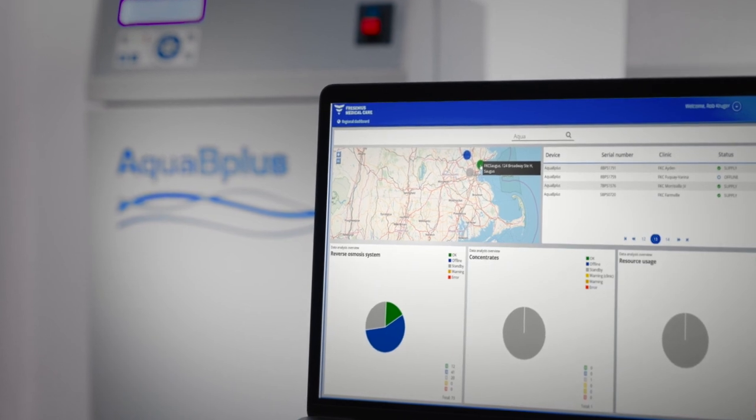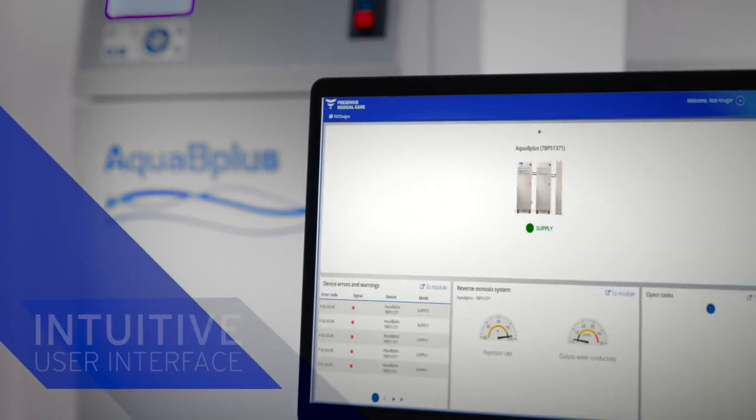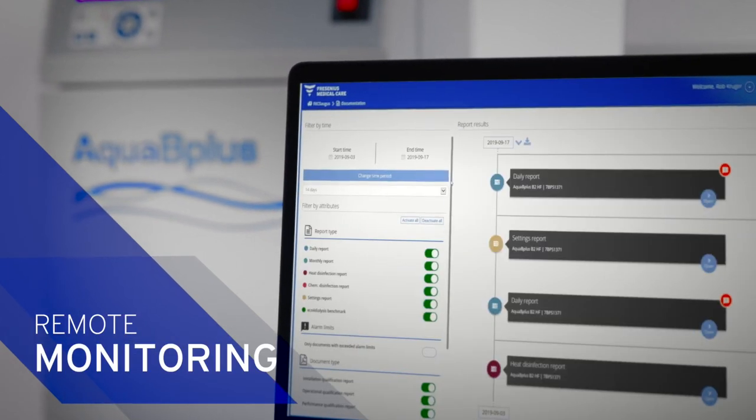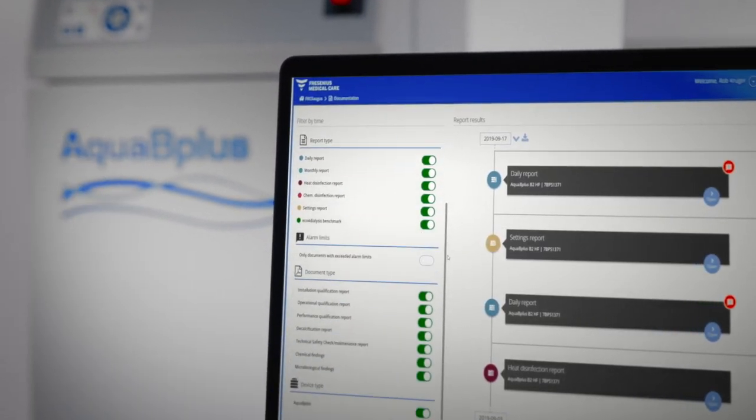For clinicians and technicians, the Aqua B Plus system offers a simple user interface, automated operations, remote online monitoring, and detailed error reporting.